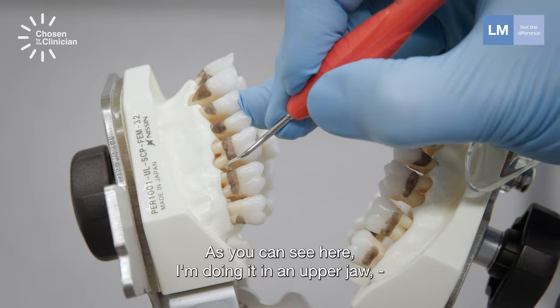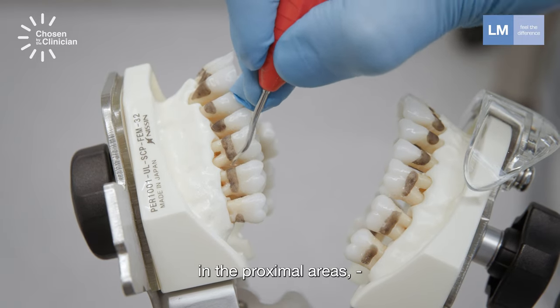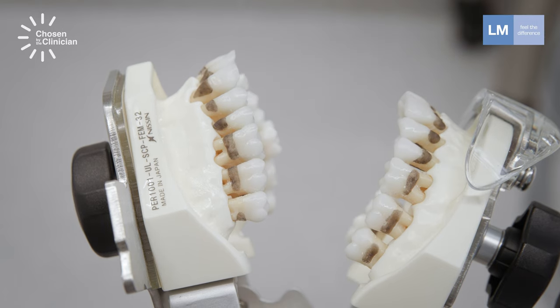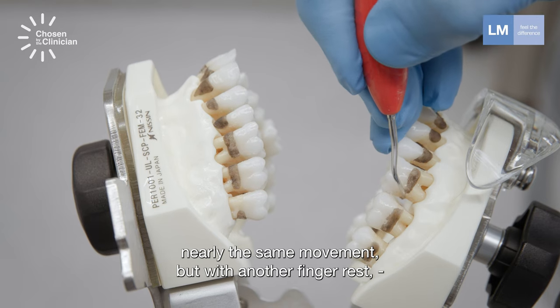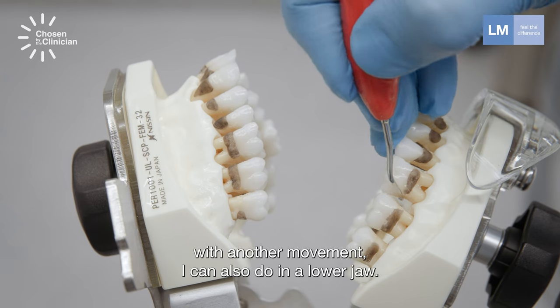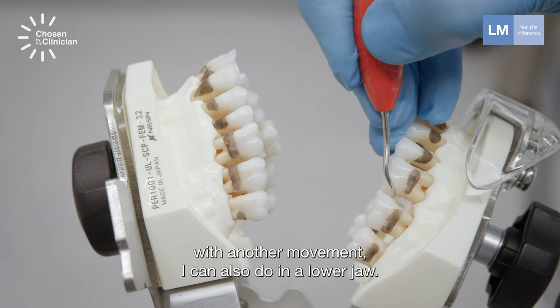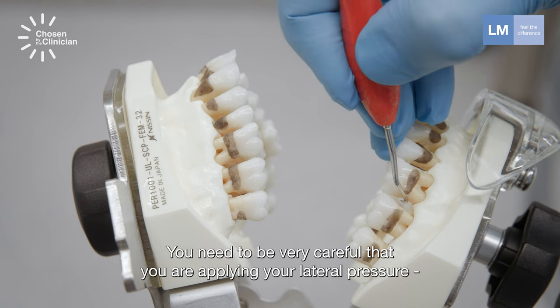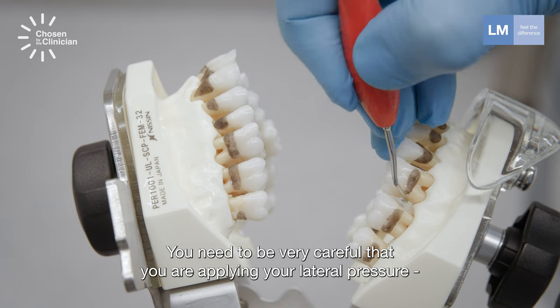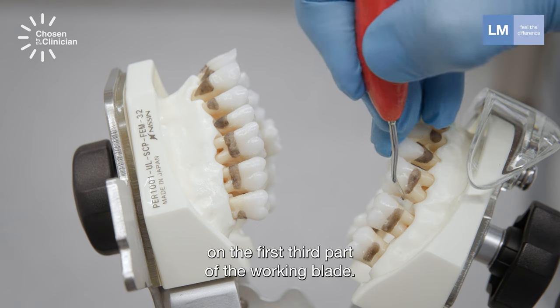The mini sickle is very effective to remove medium-sized deposits of calculus just under the gingival margin. As you can see here, I'm doing it in the upper jaw in the proximal areas — nearly the same movement, but with another finger rest and another movement, I can also do it in the lower jaw. You need to be very careful that you are applying your lateral pressure on the first third part of the working blade.